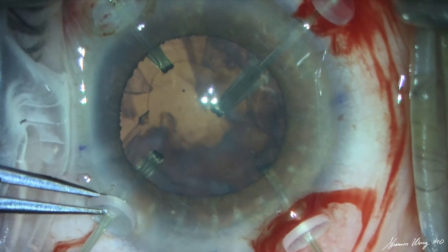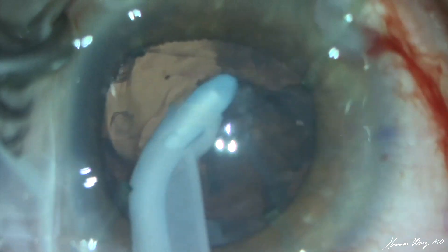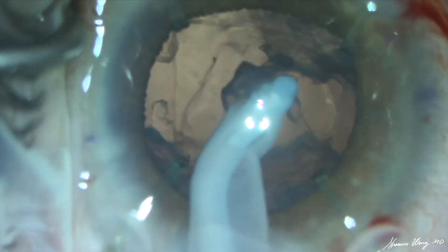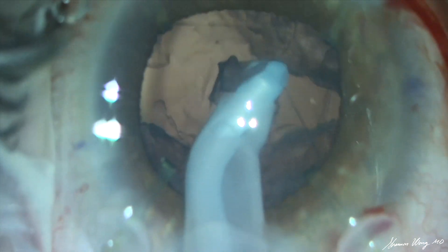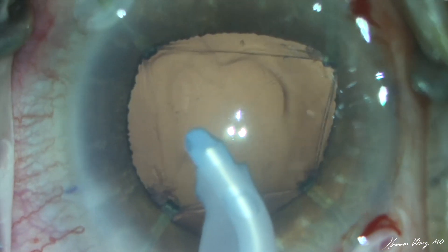We place capsular retractors to support the capsular bag to safely remove the remaining cortex. With the capsular retractors now in place, we can more confidently and safely remove the remaining cortex with less concern about creating zonular dehiscence during this process.